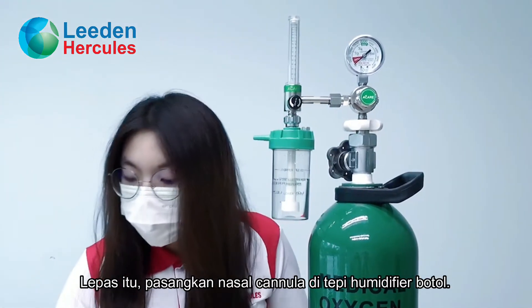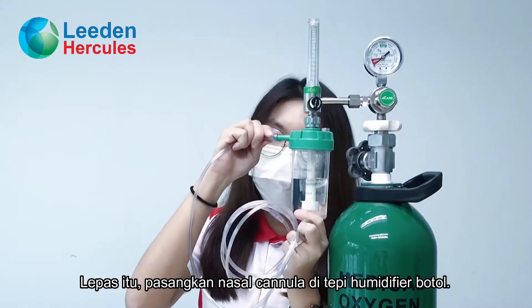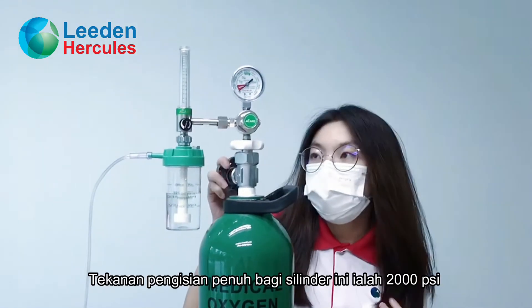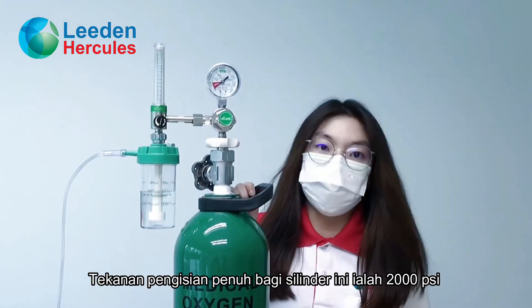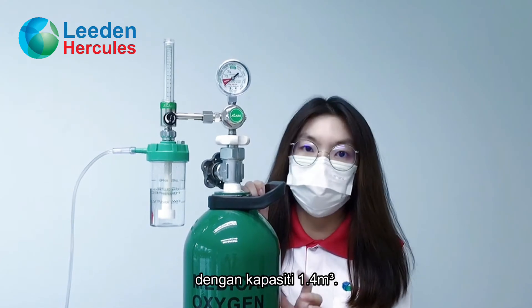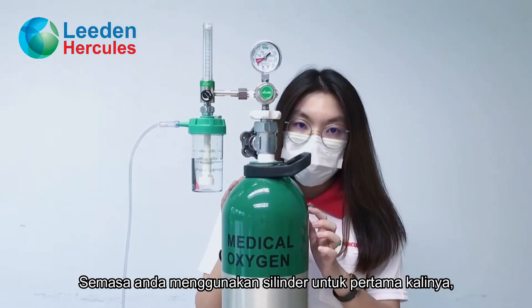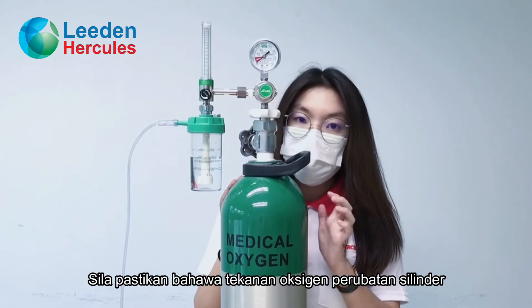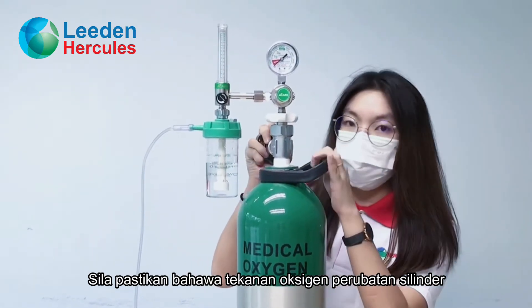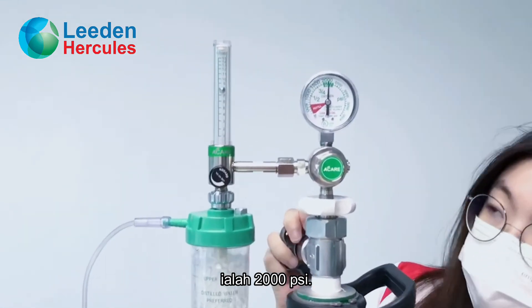Then, fix the nasal cannula beside the humidifier bottle. The full filling pressure of this cylinder is 2000 PSI with a capacity of 1.4 cubic meters. When you are using the cylinder for the first time, please make sure that the pressure of the medical oxygen cylinder is 2000 PSI.